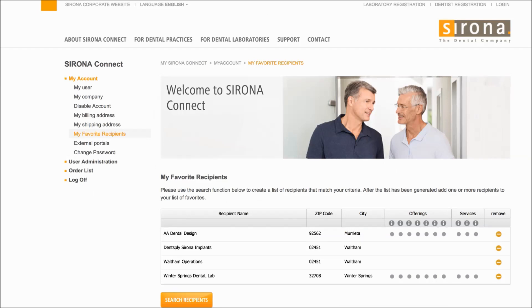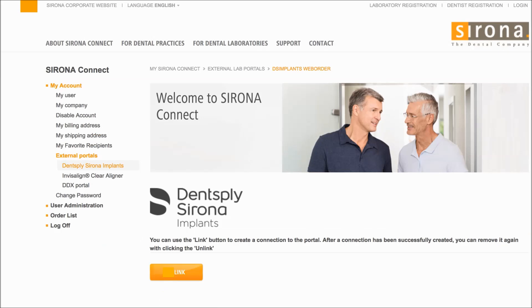There are a couple things that you need to have set up in advance of doing your first case. Number one, you have to have an account set up with Dentsply Sirona Implants. Next, you'll need to log into your Sirona Connect portal, find your favorite recipients, and add Dentsply Sirona Implants as a favorite recipient. Then you're going to go to your external portals — this may be something you've already done through Atlantis — click on Dentsply Sirona Implants, click on the link button, and that's going to bring up a place for you to enter your credentials for your Dentsply Sirona Implants account.